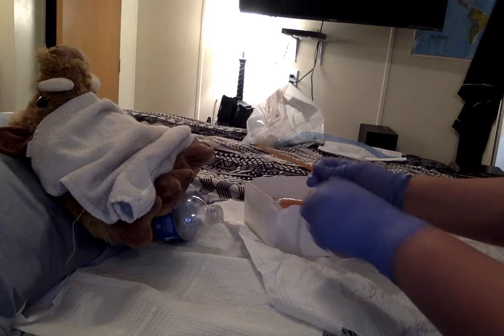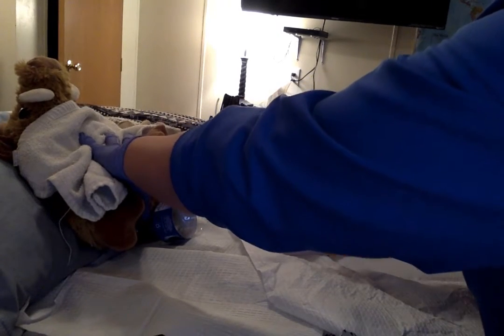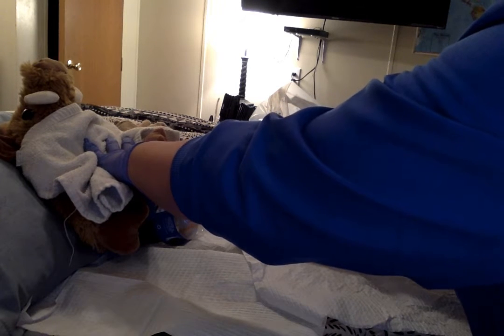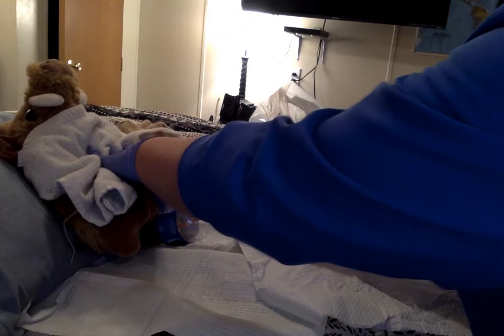We are going to, with our non-dominant hand, open up the labia, and then we are going to insert our catheter. We're going to pull back, pull back, pull back, and we're starting to see some pee. I'm going to go 1 more inch in.